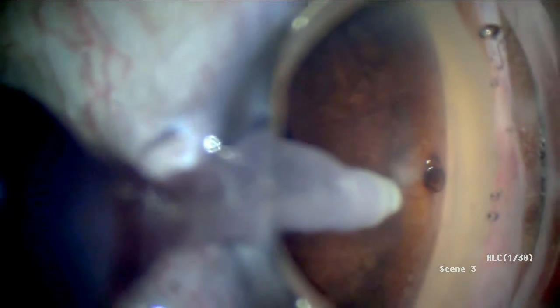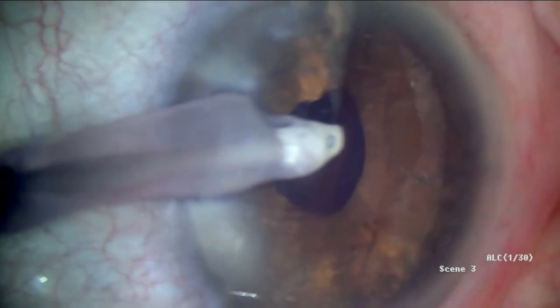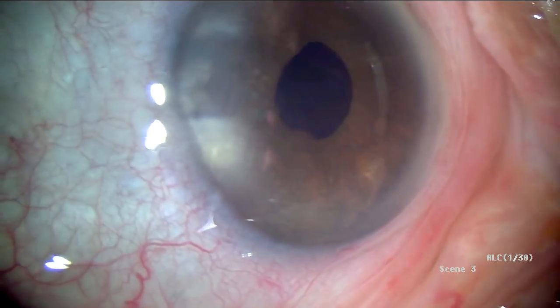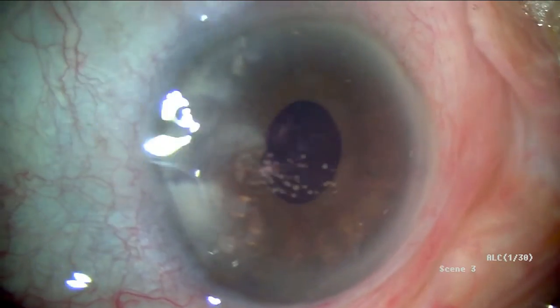In terms of efficacy, our outcomes have been comparable to those found in the Pivotal Compass trial. 73% of our patients have had an IOP reduction of 7 millimeters of mercury or more, and 93% are actually off medicines altogether. It is clinically superior to cataract surgery alone, with a sustained effect well over two years. The device is found to be safe and low-risk, with less than 3% of patients having hyphema or hypotony, and both of those events resolve without incident when they do occur.